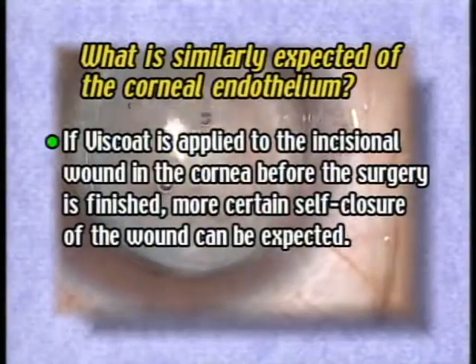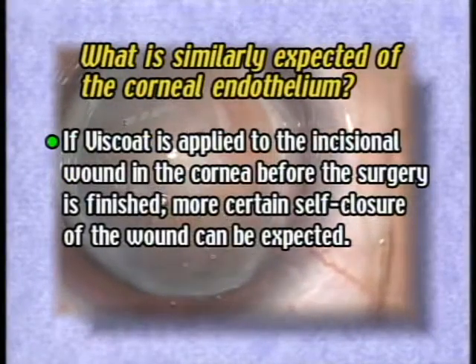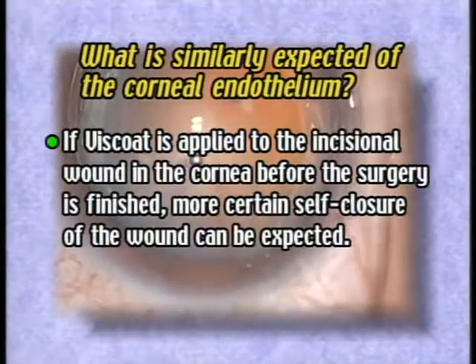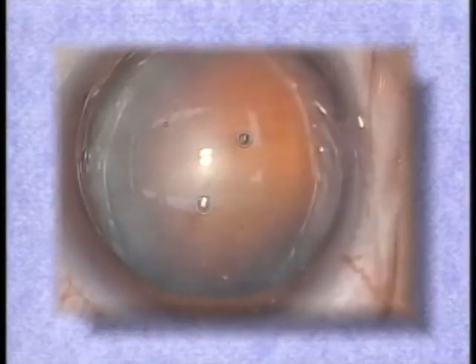If you additionally coat viscote to the incisional wound of the cornea before finishing the surgery, you can be sure that more certain self-closure of the wound can be expected. I name this method the wet shell technique and report it.